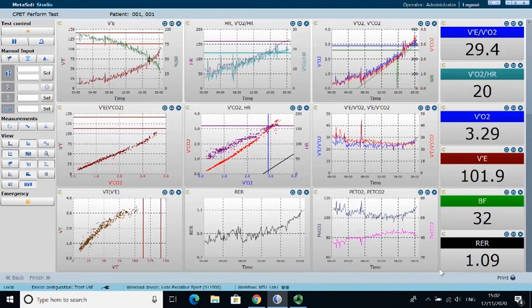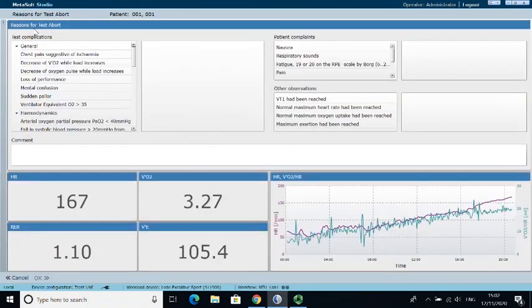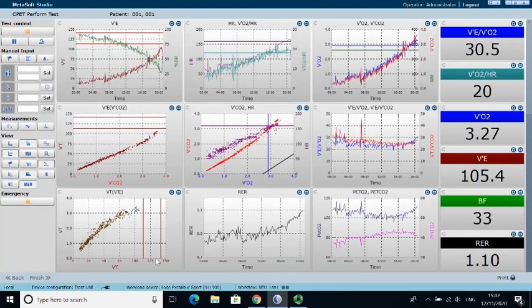And we're coming towards the end now, so I can't quite remember how I finished this video, but I think the main thing I want to get over to you is for you to see the screen, see how it works a little bit and how simple it is and how much it's done for you. And then there you go. So I've moved him into recovery there. I'm not sure it was a full max test for Matt, because I tricked him into it a little bit, but he was over 300 watts and he was getting there. He was working pretty hard by the end of it.